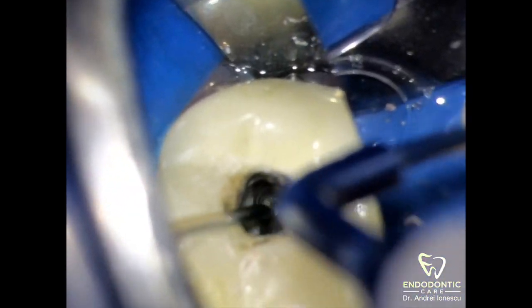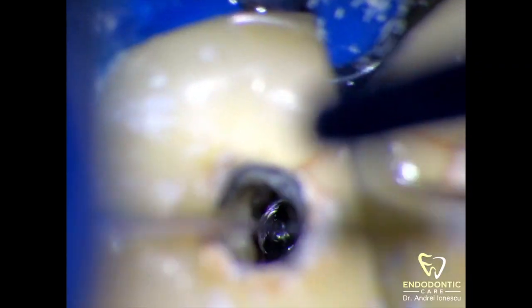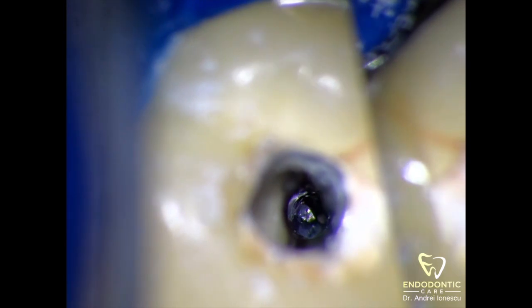This took quite a bit of time before I gave up, so I'm going to fast forward through the next part. At this point I'm satisfied I'm not going to be able to remove this file with the ultrasonic. It's not a lost cause though, because we did create about a 1 millimeter trough around this file. You can see from this photo it's on three sides of the file — I was able to remove tooth structure on two sides but not on the exterior part of the curvature, which is on your left-hand side.